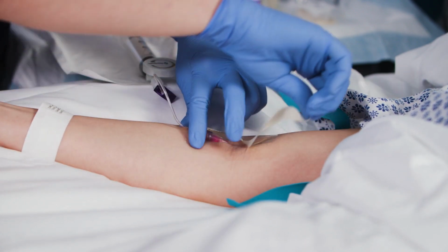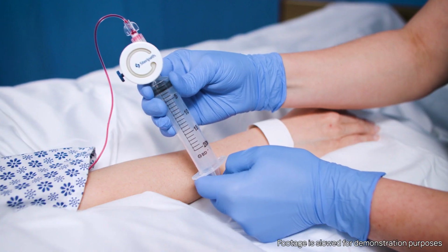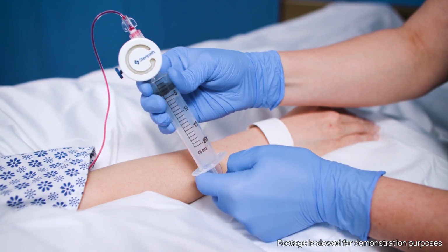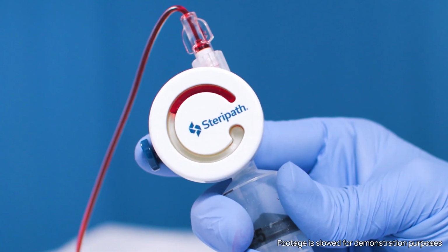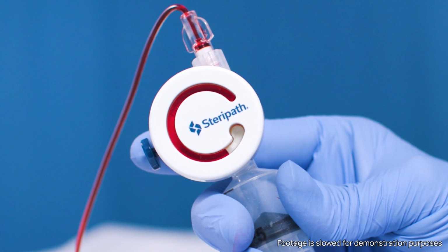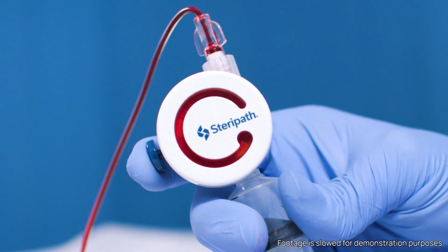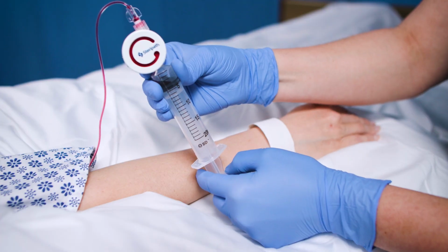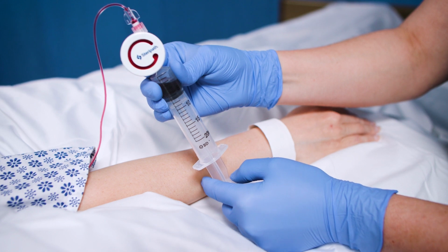After connecting Steripath Micro to IV catheter, slowly and steadily draw syringe plunger to divert initial specimen of blood into the C-shaped diversion chamber. Monitor blood flow into diversion chamber until it is full. Fully depress the button on the side of the diversion device to lock in potential contaminants. Continue pulling back on syringe plunger to collect blood culture sample following standard procedure.